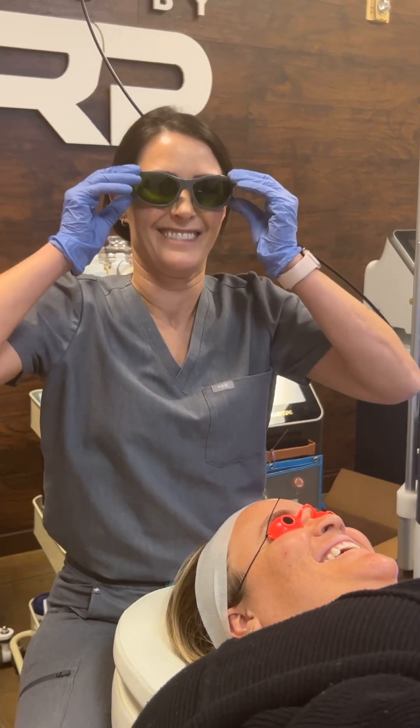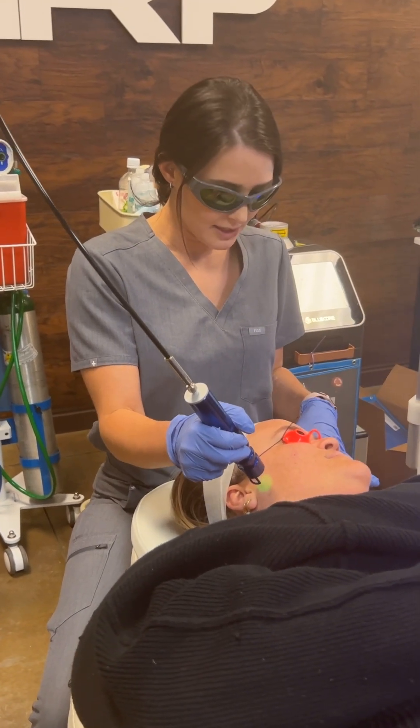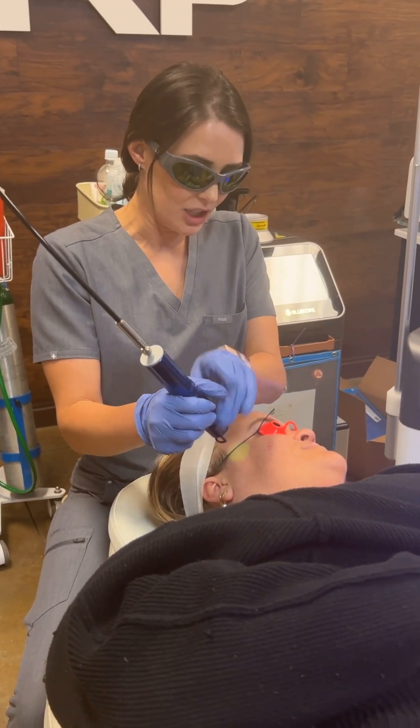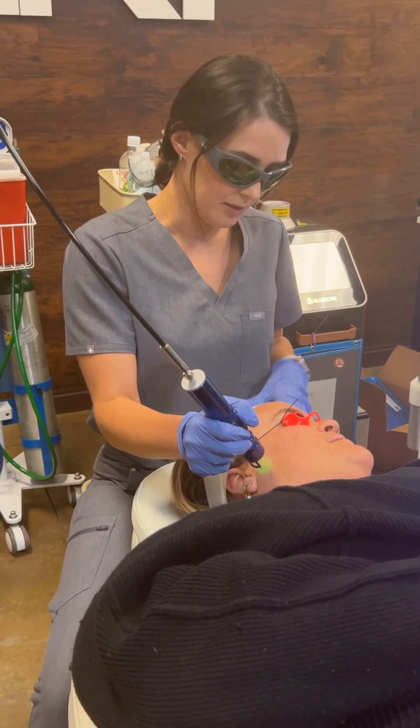We're going to do two to three passes on her. It's going to be a bright light. She should feel some warmth — there shouldn't be any stinging or discomfort. You can hear some loud snapping, which could be a little intimidating, but it shouldn't be uncomfortable. If it gets too hot, let me know.